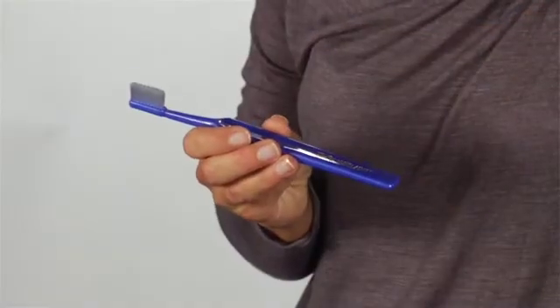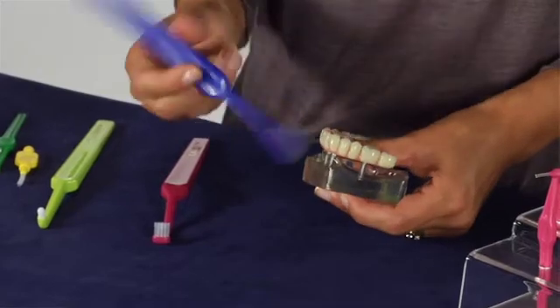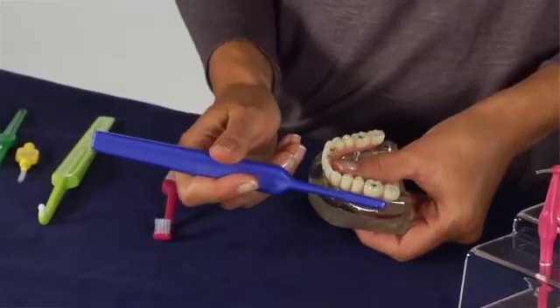TP Implant Brush is a two-row brush with an extra narrow brush head, which makes it easy to clean the implant surface from the outside.